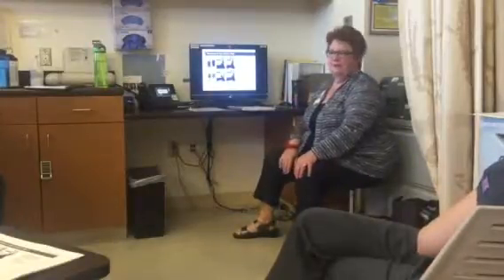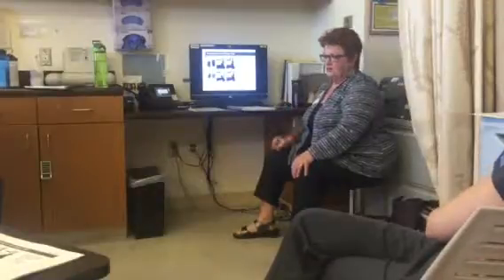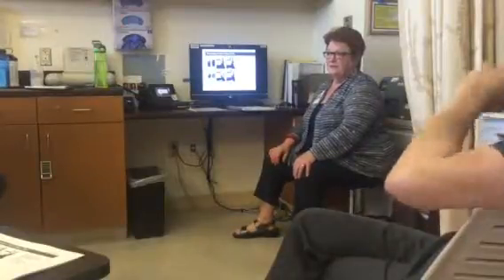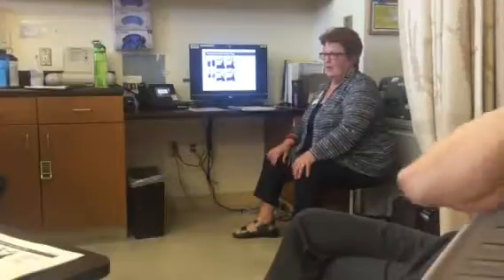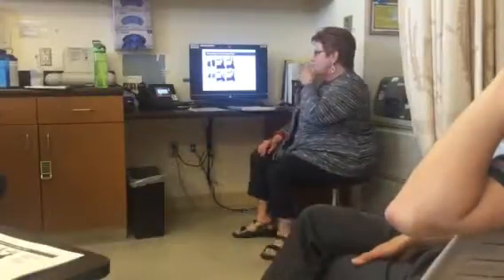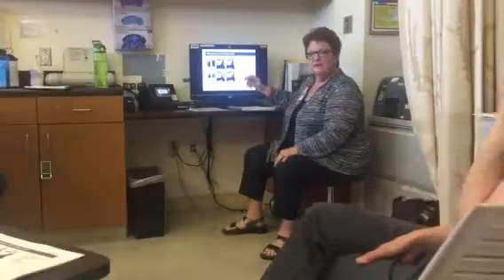My favorite one, clumping. These are the exact same images that came out of your MNC training workbook. This should not look mysterious to you. There are 2 places there can be clumping. What are they? The collect port and/or the interface. Okay, so let's look at the interface first, because that one is sometimes a little more difficult to assess.